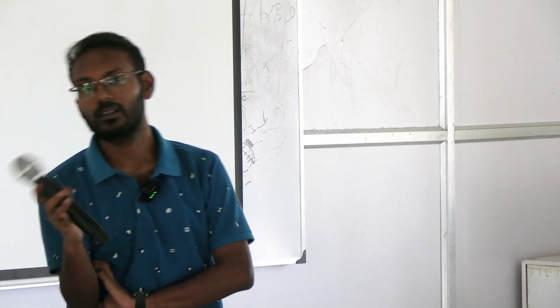Tell me what is the test you are performing now. Last we are making and counting of blood WBCs. What is the official name of the test? Leukocyte differentiation of leukocytes. DLC. Yes, DLC. What is that? Differential leukocyte count.